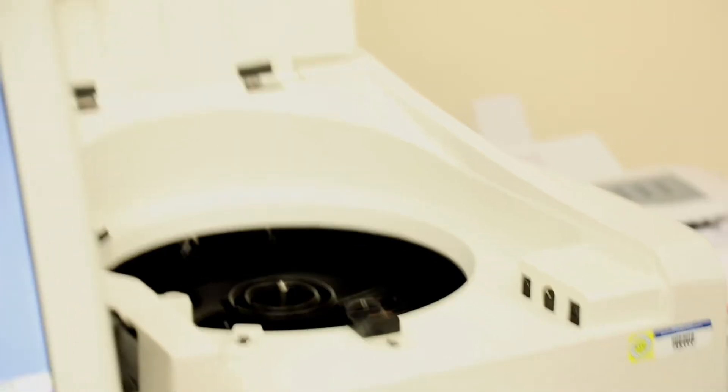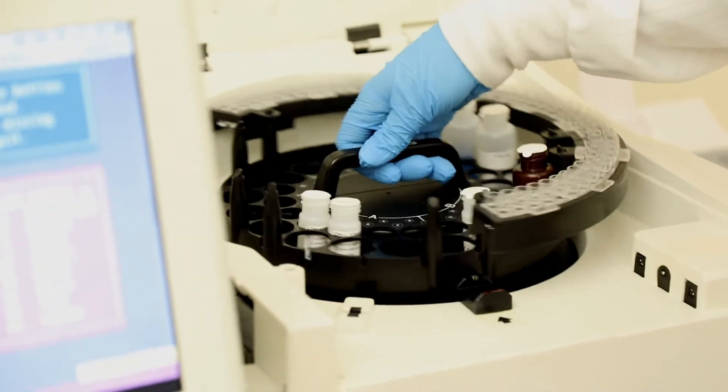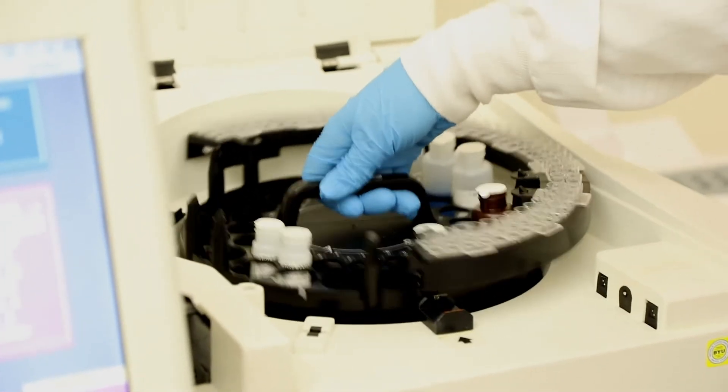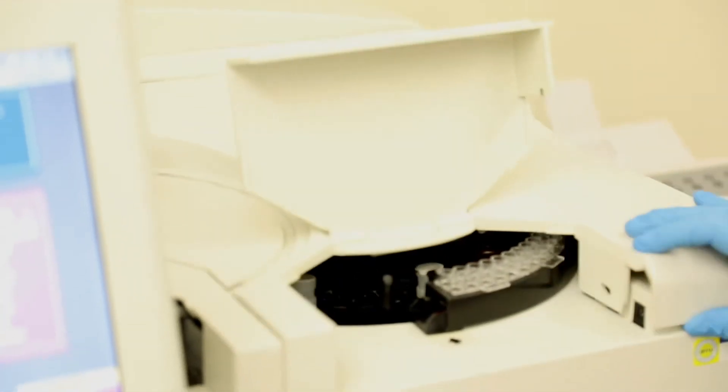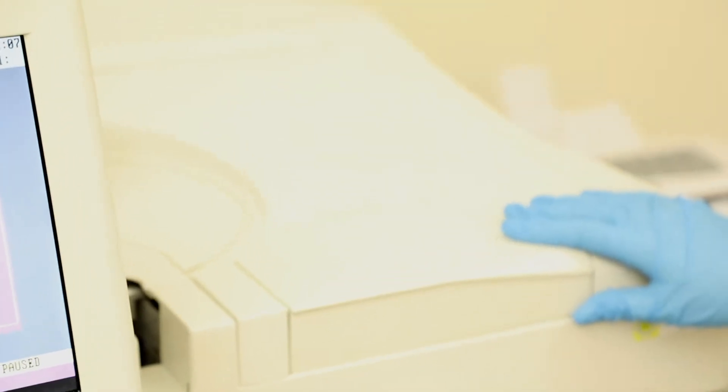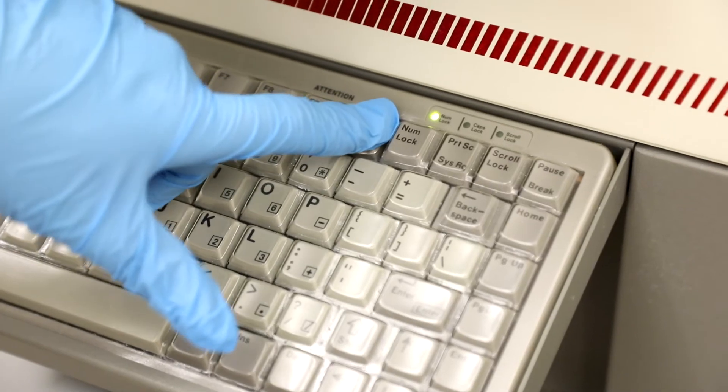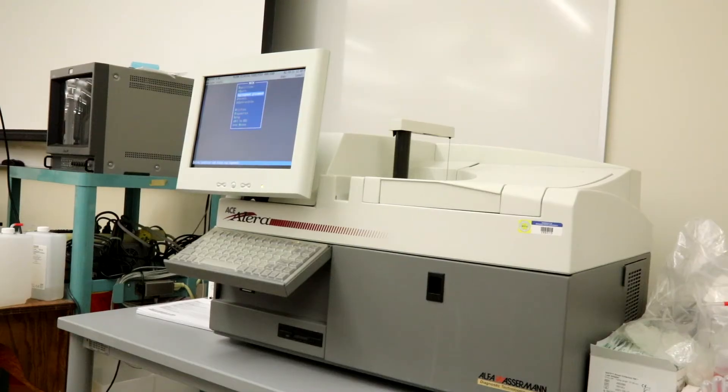Place the carousel back in the compartment, making sure it's sitting properly, then close the lid. To complete the process, hit Accept, which is the key F10.